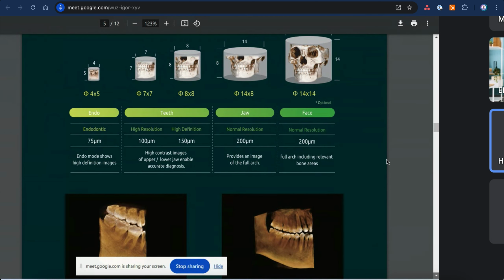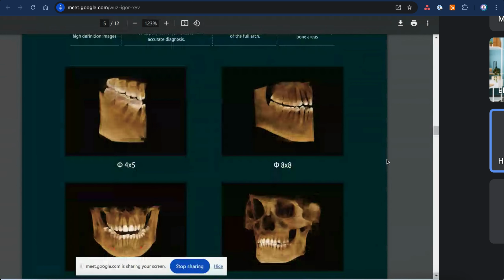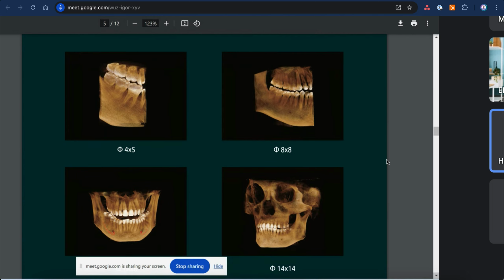This is how it appears in the CT, and the amazing thing is I can move the skull and the teeth, like between my hands in 3D dimensions with the software. It's exactly as if you are doing it with your hands, like just look at it from in front, behind, left and right. It's exactly as if it is between your hands. I can see it in all three dimensions.